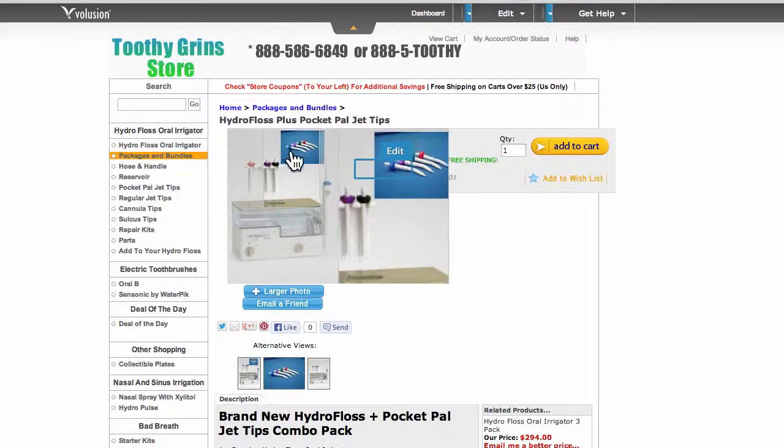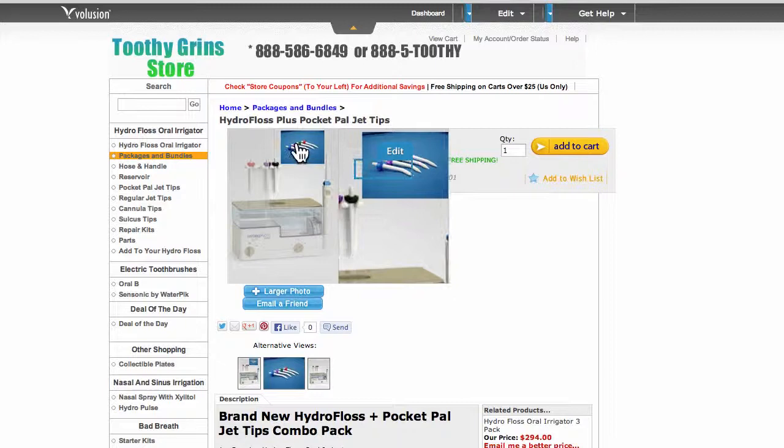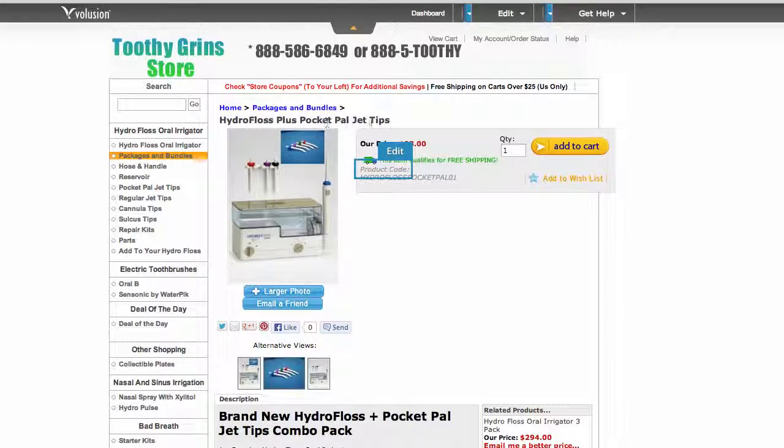The PocketPal Jet Tips are special tips that come with special instructions. In this combo package you'll get four of the regular tips and four of the PocketPal tips. They come with special instructions that help you do an even better job at prevention. This is where the power of the HydroFloss plus the PocketPal Jet Tip combination comes in handy.